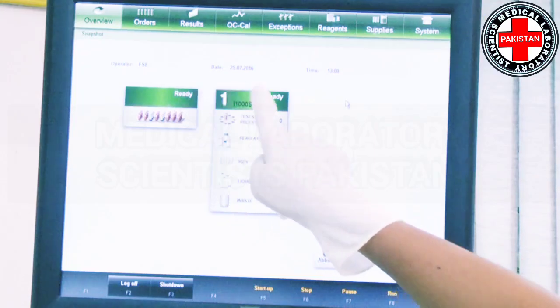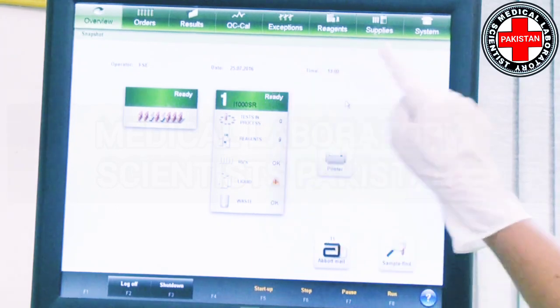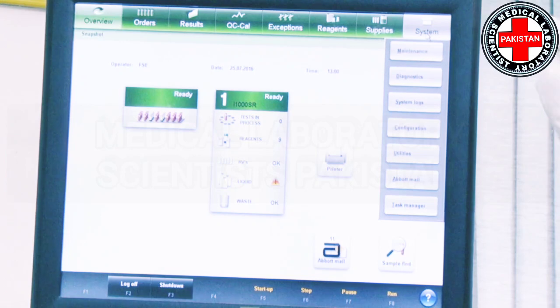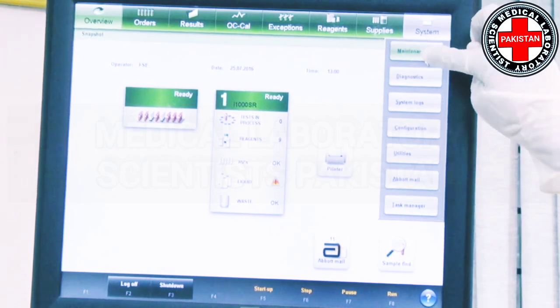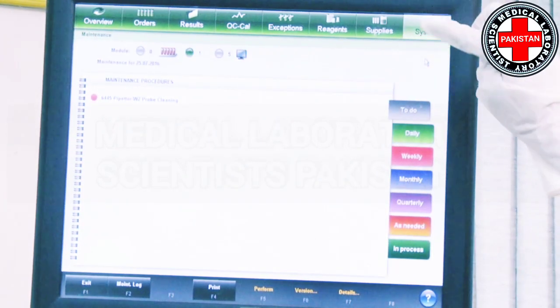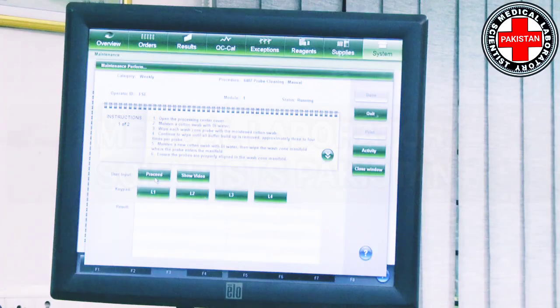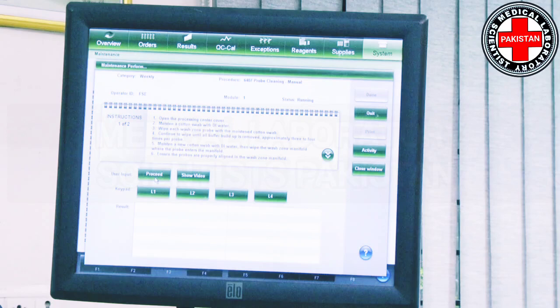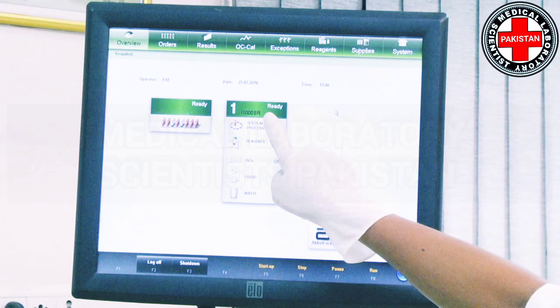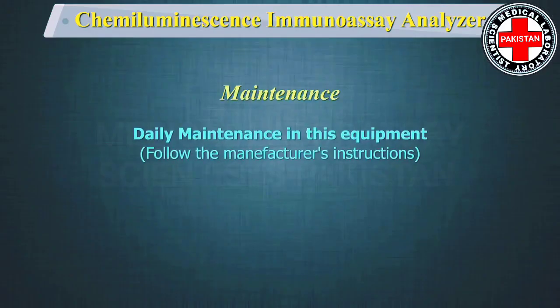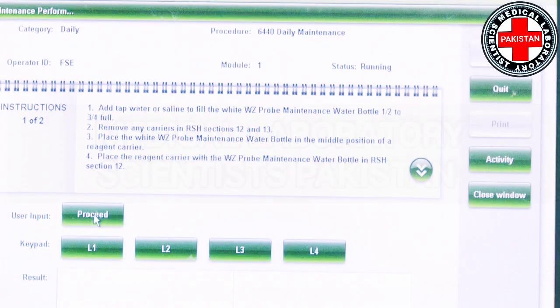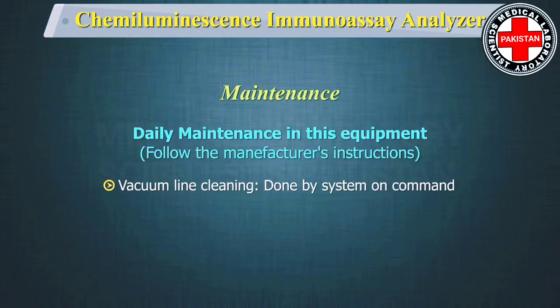The system software provides a user-friendly interface for performing and tracking maintenance activities. The maintenance screen displays procedures scheduled to be performed, and once you initiate a procedure, step-by-step instructions walk you through its completion. Understand the biohazard symbols depicted on the machine before proceeding with maintenance, as you may be exposed to potentially infectious material. Daily maintenance includes probe cleaning and vacuum line cleaning, both done on command by the system.